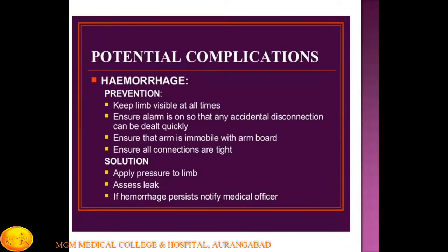The complications, as I told, these are invasive procedures. The complication is hemorrhage. So if you poke the artery very badly, very roughly, then there can be a tremendous hemorrhage inside, and a hematoma can form. So we have to be very, very careful. Systematically, we have to go.